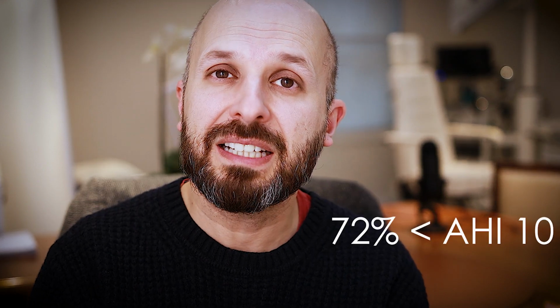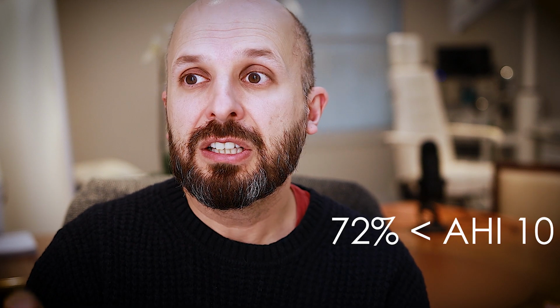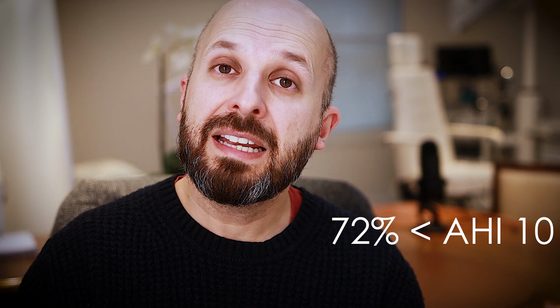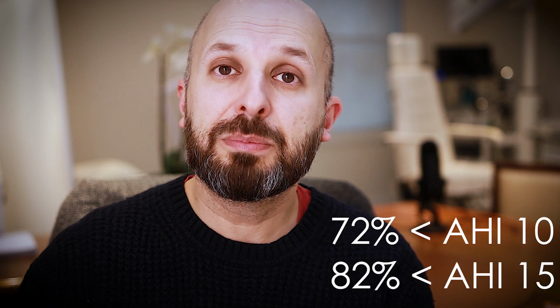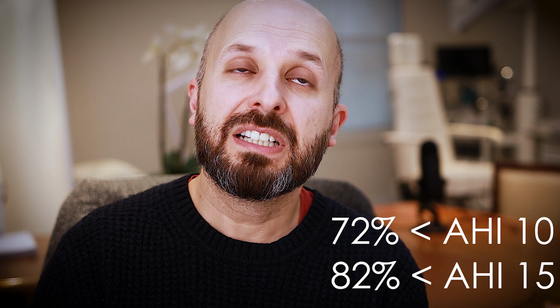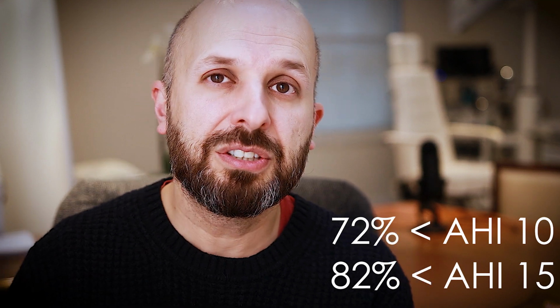Now, the number of people that were brought down to less than 10 on their AHI, so better than you would expect CPAP to be helpful for, was approximately 72%. So 72% of people got a result which was slightly better or better than CPAP. And in this study, 82% of people brought their AHI down to less than 15. So that would be a result to the point where you no longer need to use your CPAP.